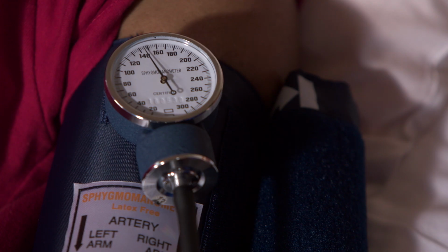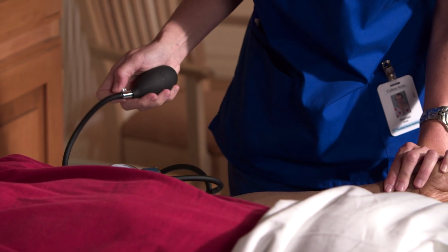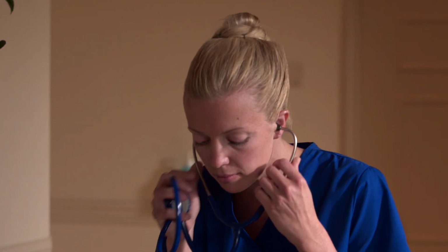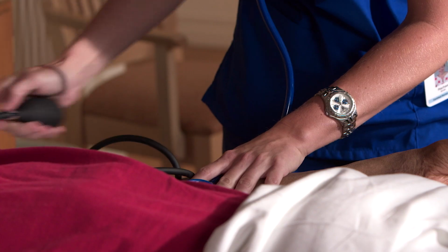Look at the gauge and note the reading, which is an estimate of the systolic pressure. Let the air out of the cuff quickly by turning the valve to the left. Put the earpieces in your ears with the tips facing forward toward your nose. Place the diaphragm of the stethoscope firmly over the person's brachial pulse.